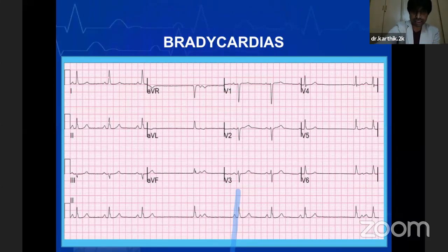So here you can see that the QRS complex is normal. It's neither broad nor narrow. There is a P wave which is followed by a QRS complex. If you see the rhythm strip, that is lead 2, which is located at the bottommost line of the ECG shown here, you can see that the first beat is having a P wave QRS relationship. Second beat is having a P wave QRS relationship. Third beat is having a P QRS relationship. And if you see, the PR interval is more or less the same for all these beats.